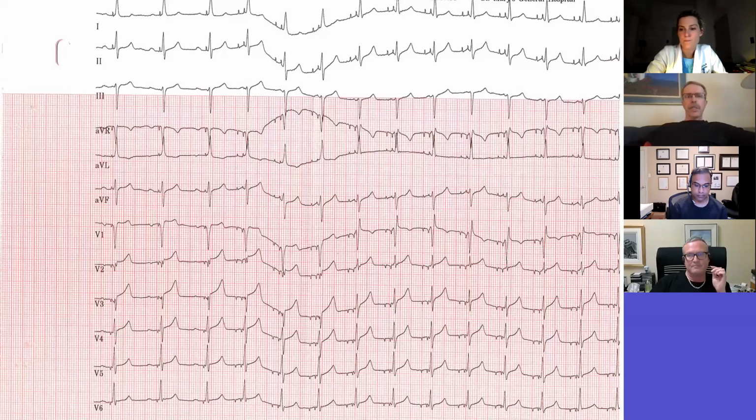Yeah, I certainly have seen ones though, the rare one, because sometimes the higher output is significantly narrower. So maybe we are capturing the right bundle, but that's the rare one. Mostly it's like this. Every other lead, if you look at lead 3, you couldn't tell that there's any change. No. So really, I think it is probably just anodal stim, capturing myocardium and depolarizing where that R prime comes from.